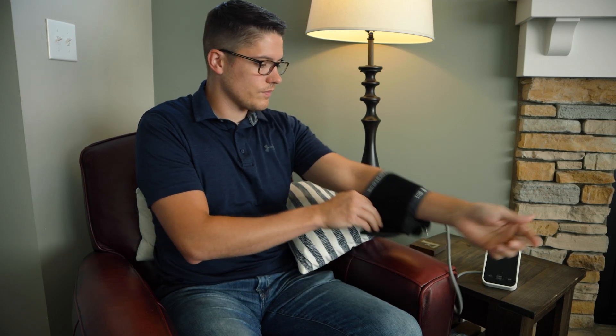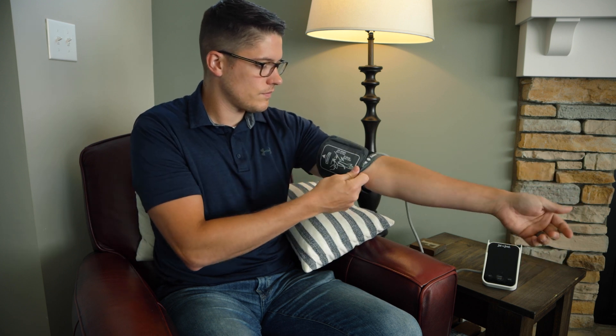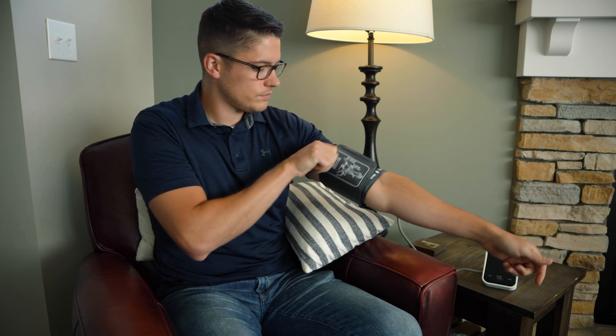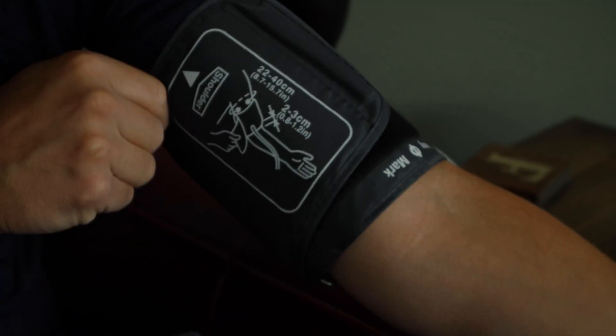Now let's go ahead and take my blood pressure with this unit right now. It's best to sit in a chair with your back supported and feet flat on the floor, with the blood pressure cuff at heart level to ensure an accurate and consistent reading from day to day. Sit up tall and slide your arm into the cuff, making note of the artery marking and the arrow that should point toward your shoulder.